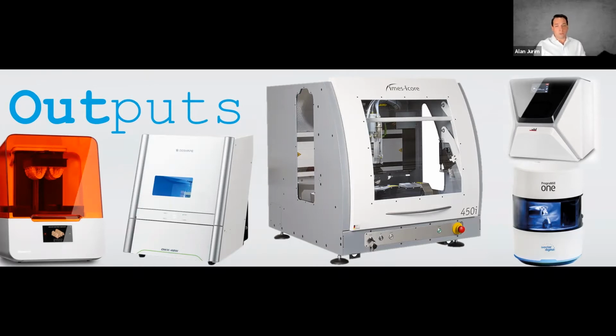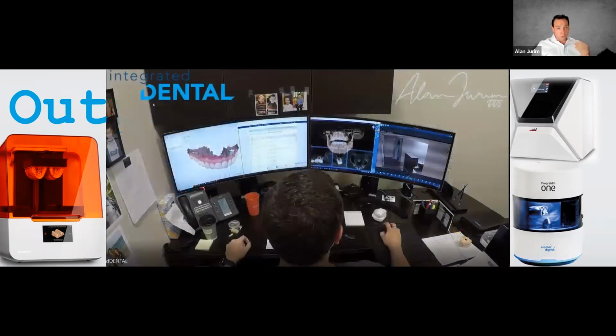And to give you a brief overview, milling is where we take a solid block of material and keep cutting at it until we end up with what we want. And 3D printing, on the other hand, is an additive manufacturing process where we create layer by layer images that then get stitched together and built into a 3D model. Another very important output that's always overlooked is just a computer screen in itself.